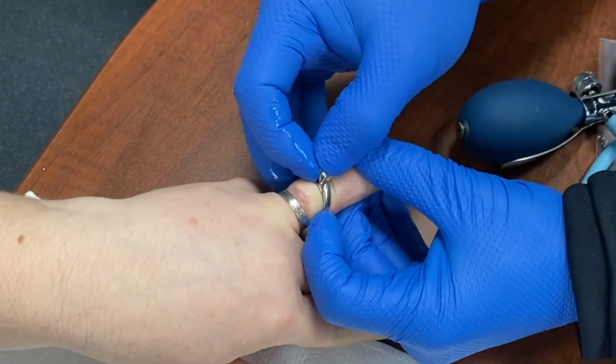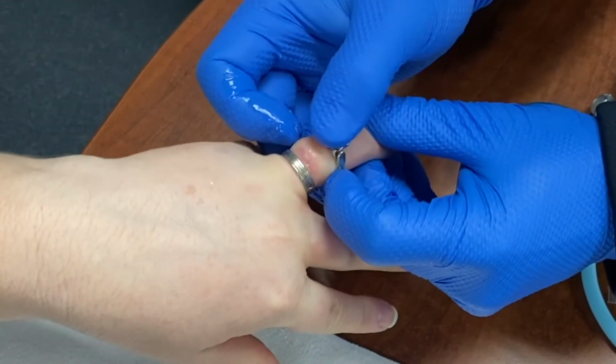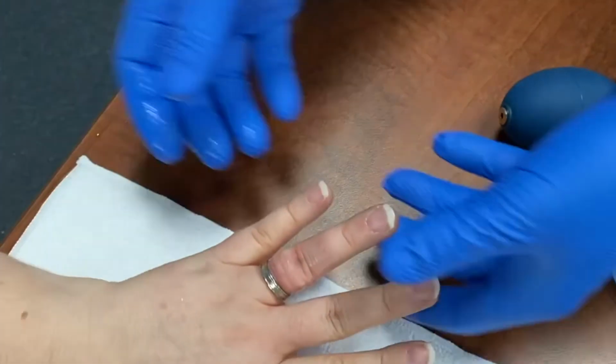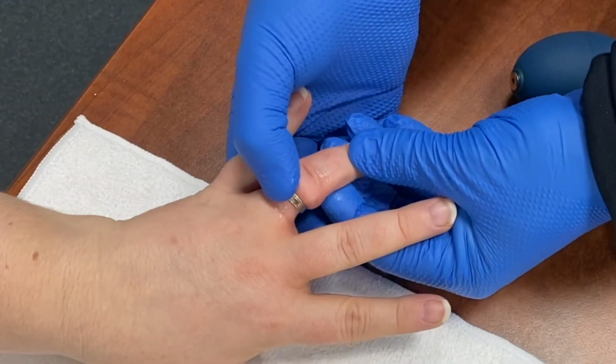Look at that. Just doing corkscrew alone. Now the other thing is there's a rocker where we can rock it back and forth a bit. That helps us get a little bit. But this one came off. Look at that. There's one. Now I can go back and compress the finger again, or we can keep moving. We'll just try and keep going.